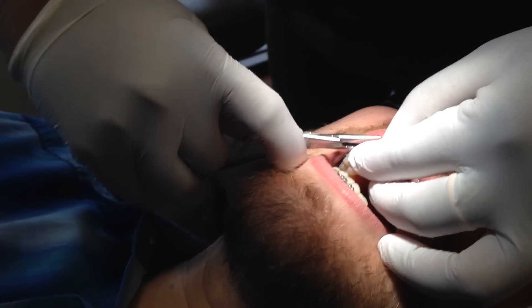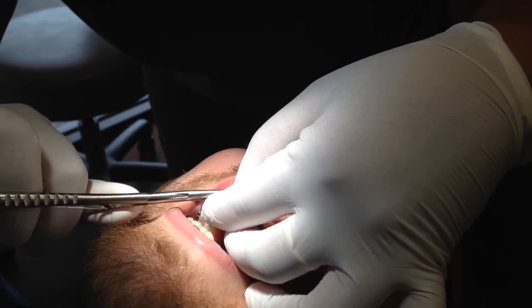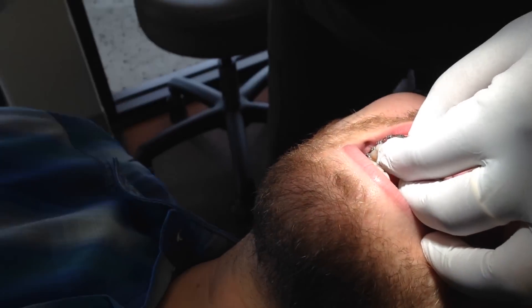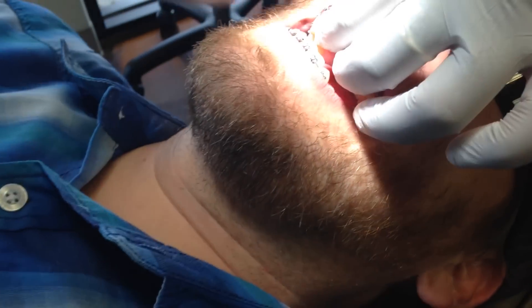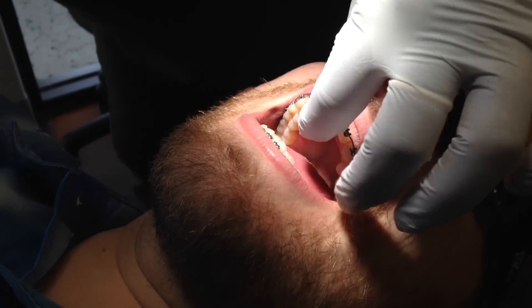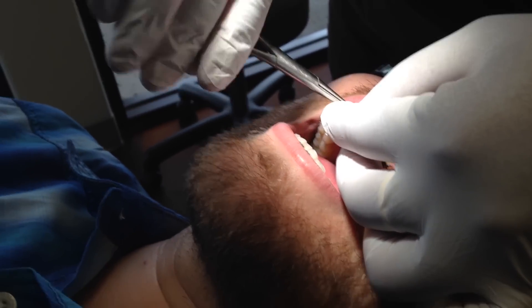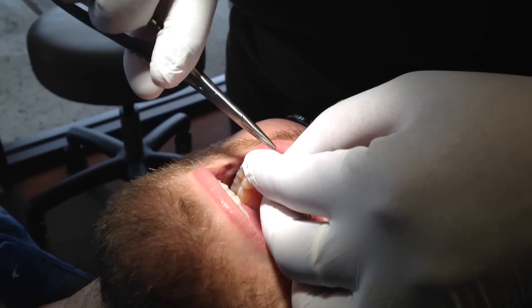So what exactly are you doing to his teeth again? I'm taking this wire tie off. I didn't know you guys could put two rubber bands on each tooth like Grygidomy and Stephanie. Yeah, that was cool.